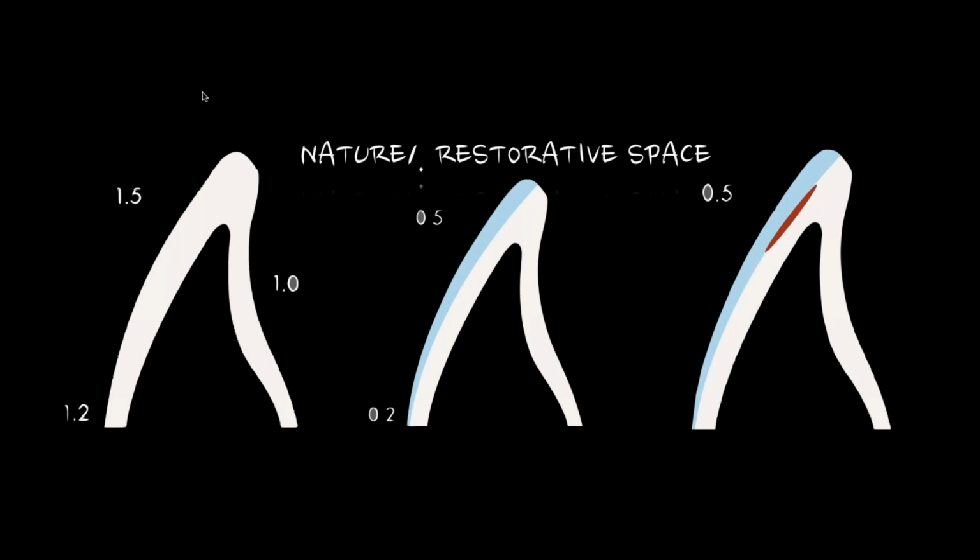And the reason these numbers are so important, and I'm sure many of you heard me throw these numbers out so many times, is because you need to understand that everything we've done in dentistry has basically been designed around this parameter. So every ceramic material that's made, almost every restorative material, whether it's a monolithic material or a substructure material, or ceramic in general, which is really the biggest challenge, they've all basically been designed around filling this space, 1.2 to 1.5.